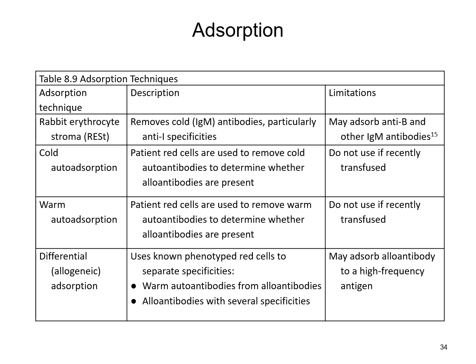So it goes through a process where you're allowing the patient's red cells to remove those antibodies, and then you'll spin it down, remove that plasma, and then you repeat this process again with more of the patient's red blood cells using that same aliquot of plasma to hopefully remove all of those antibodies, and you would do different enhancement and things to assist with that along the way.